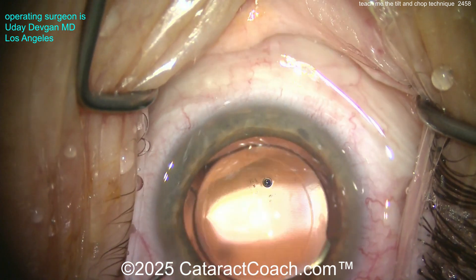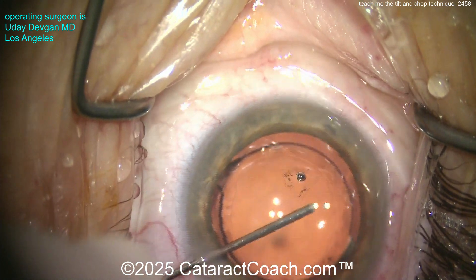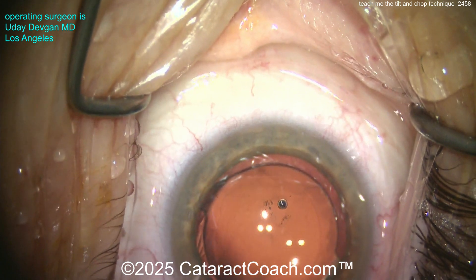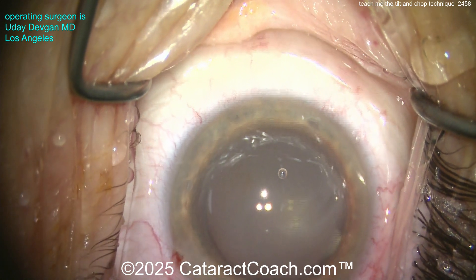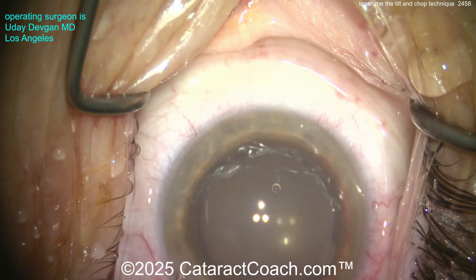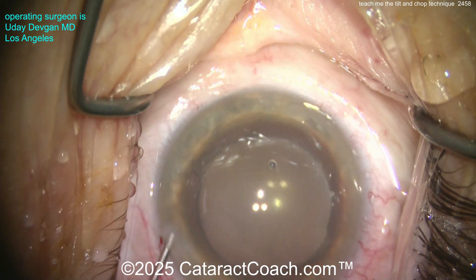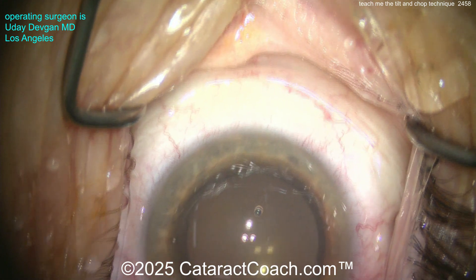Let's seal up the incision. Notice how I hydrate the roof of the incision — don't hydrate the sidewalls. You want to hydrate the roof of the incision, nice and gently. A little preservative-free triamcinolone — not much, 0.5 milligrams — just enough to quiet down the eye; it's almost all gone by post-op day one. Now a little bit of antibiotic going inside the eye too: preservative-free moxifloxacin, just to be sure.